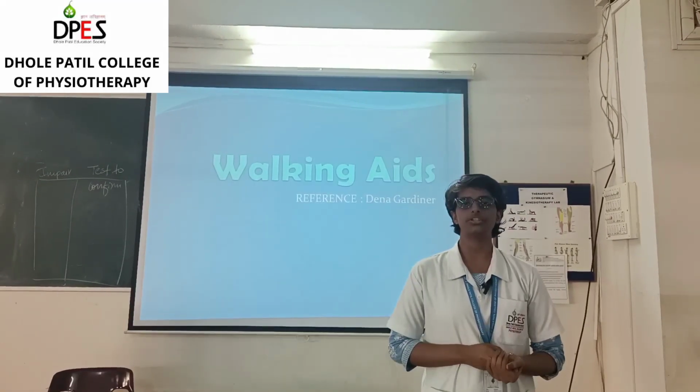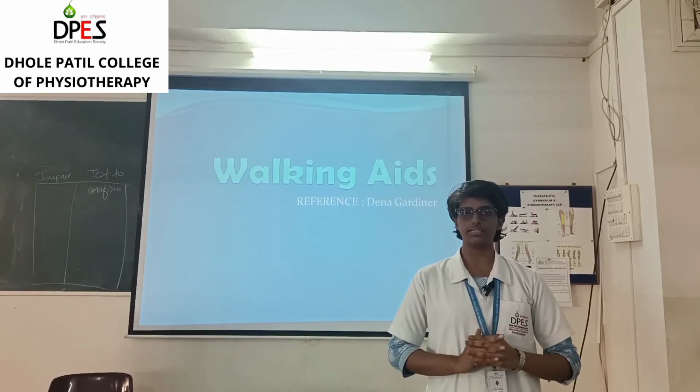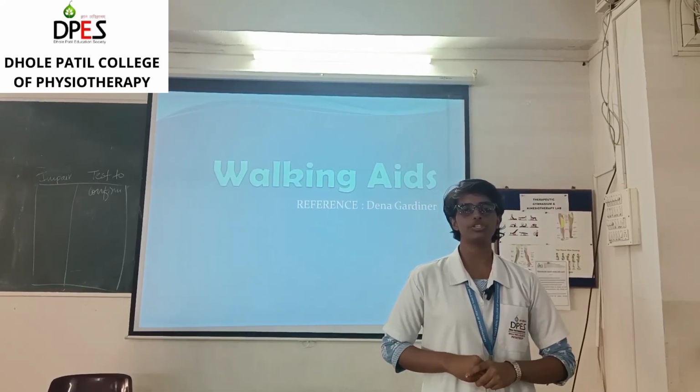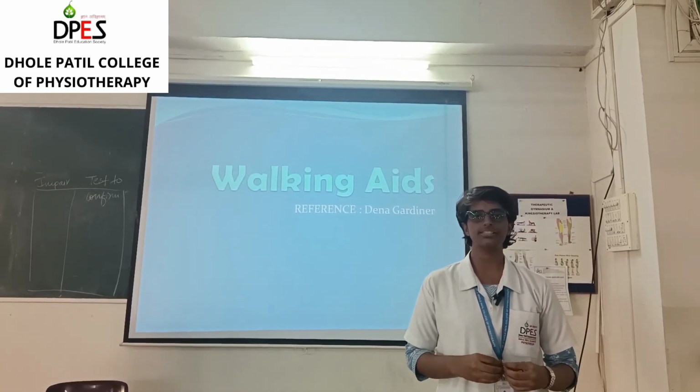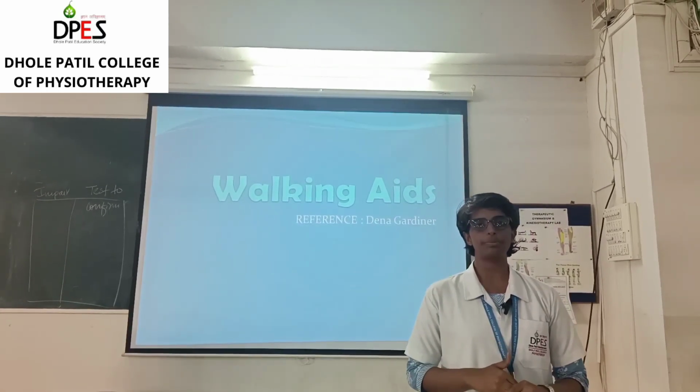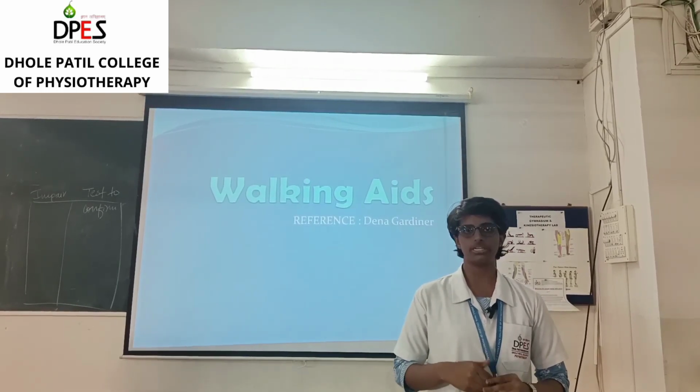I am currently studying at Dhole Patil College of Physiotherapy in second year. Today I am going to share some information on walking aids in the simplest way possible. So what are walking aids? Walking aids are the devices which are used by people who cannot walk independently or have difficulty in walking.